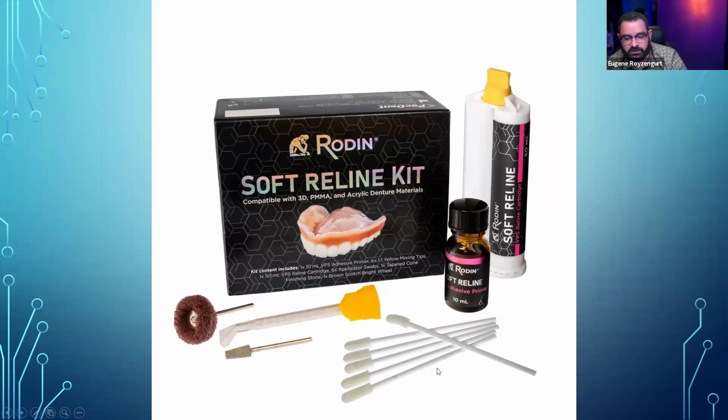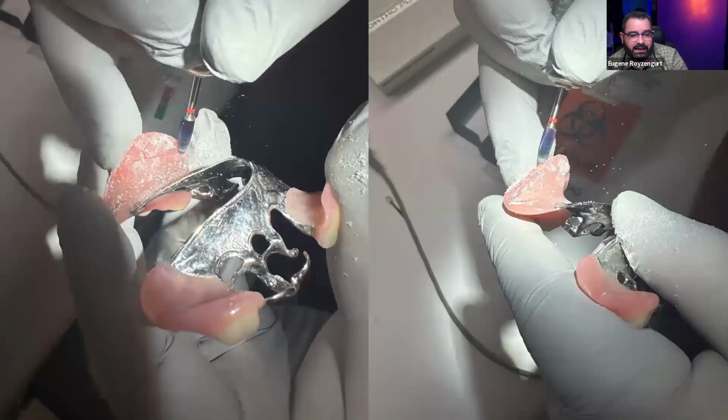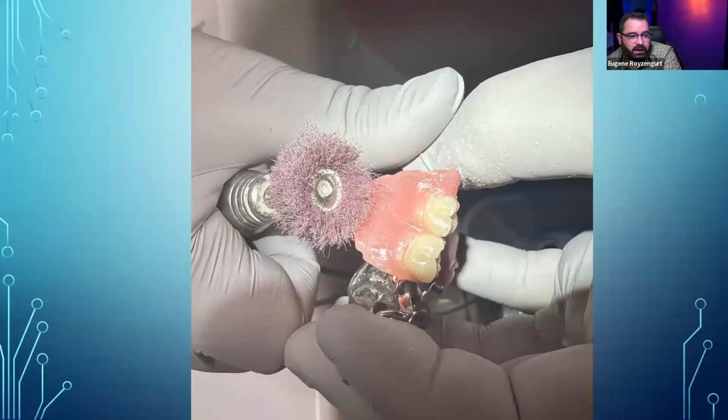So basically, I had a case where I was working with one of the residents at the general practice residency at the University of Utah, and this patient needed a partial denture obturator. Once the denture was processed, chair side, we reduced the surface of the denture to create this nice little butt joint, okay? And with that, we were able to create a nice and flush margin, right?